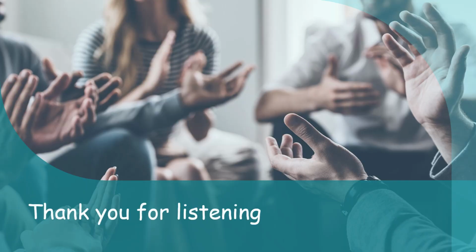So that's the end of this Skillshare session. Thank you so much for listening to the session, and I really hope that's given you a little bit of that foundational knowledge into how to model to your individual the AAC device, and also how to navigate the initial steps. I think the key thing to remember is that as the child is learning to use AAC, we are also learning to use it.